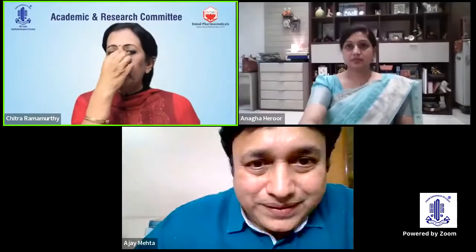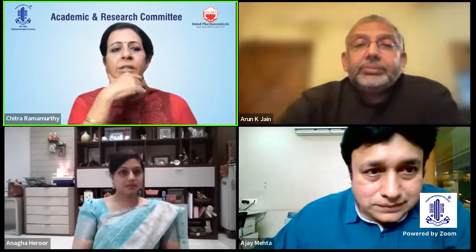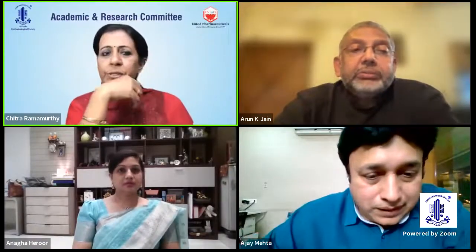Thank you very much, Dr. Ajay. I think it was a particular brand of lens. Was it a hydrophilic IOL which we were using?